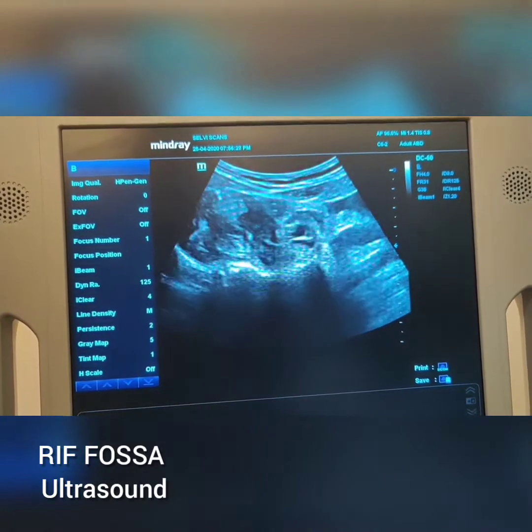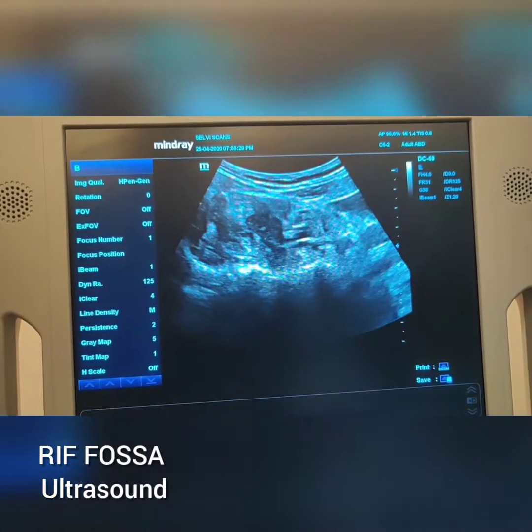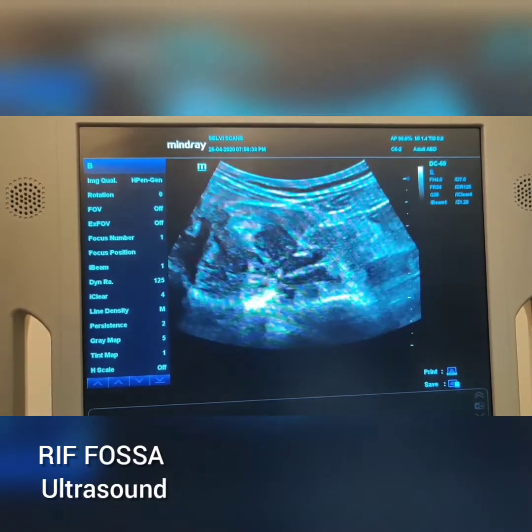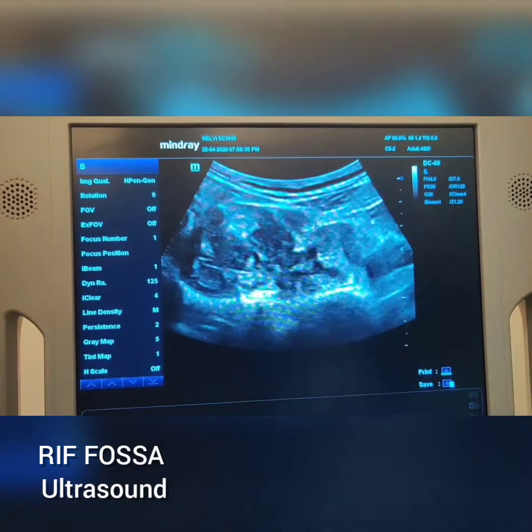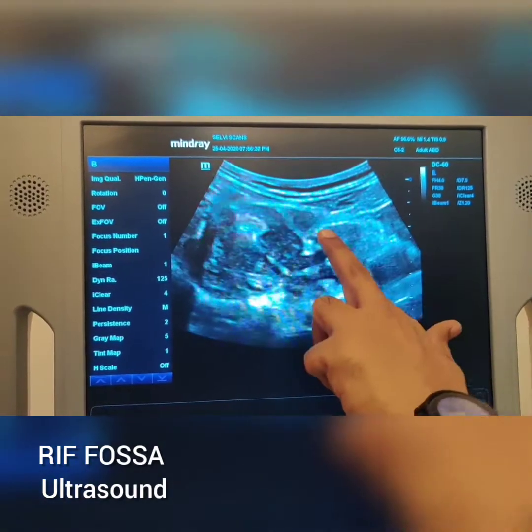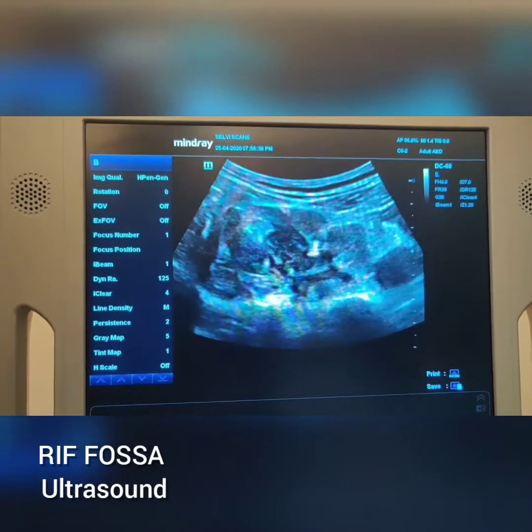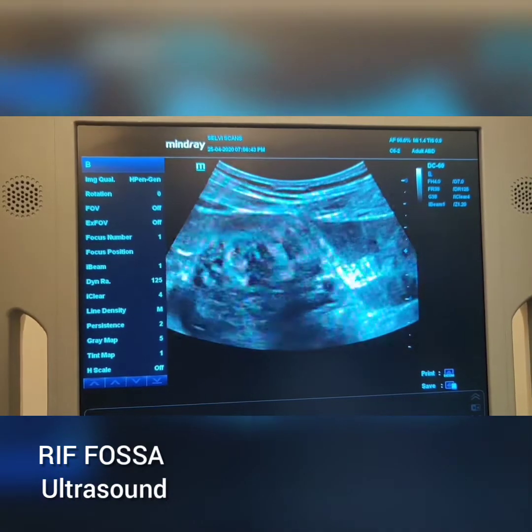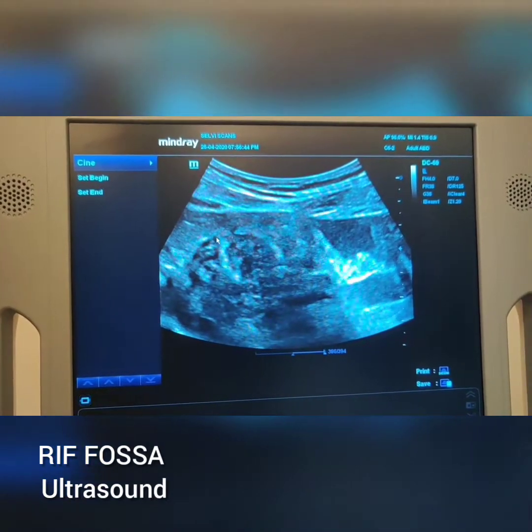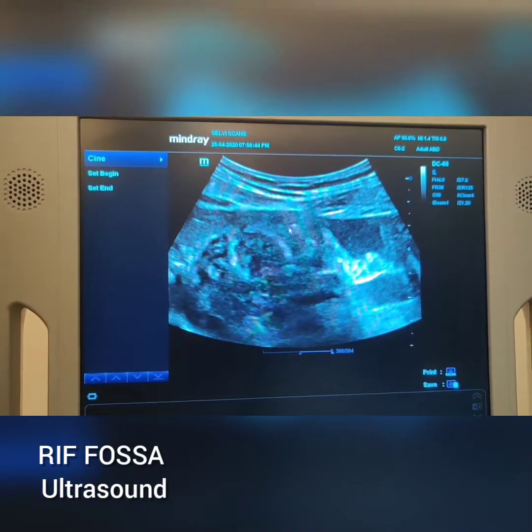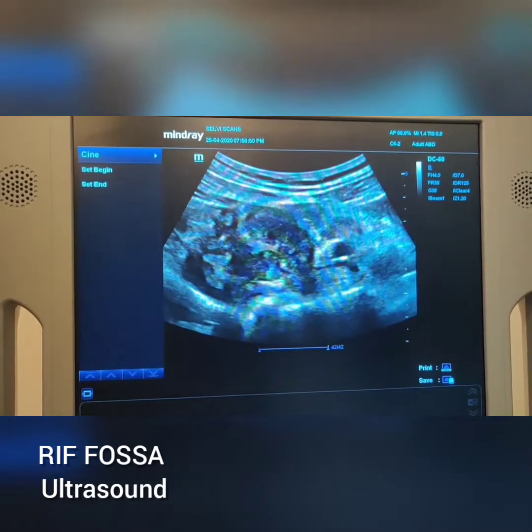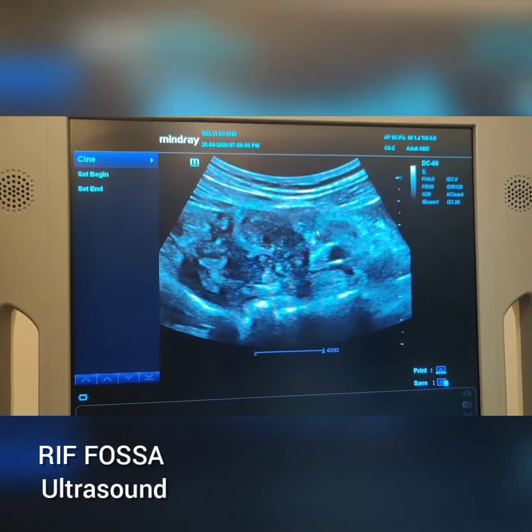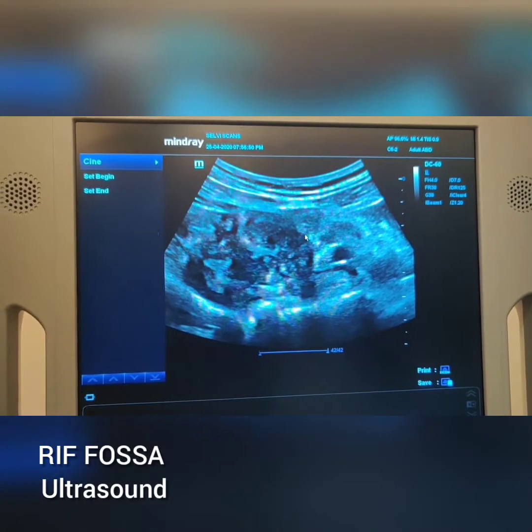Transverse scan is very important to look for any pathology in the RIF. When you see the iliac vessel, reduce the depth — posterior to the vessel is not so important. You have to see what is anterior. Now when I take the pressure off, you can see a lot of hyperechoic structures — those are the ileal loops. That's where you try to see the appendix — non-compressible, aperistaltic.